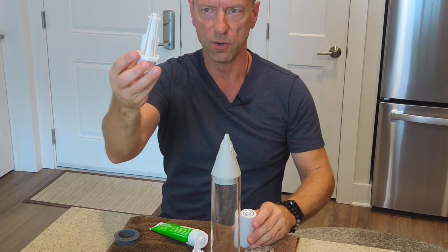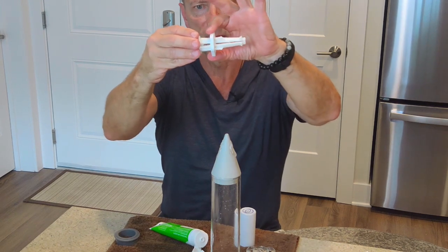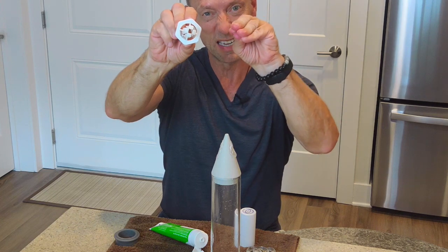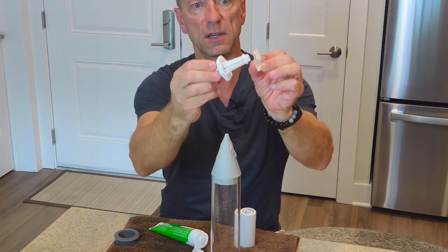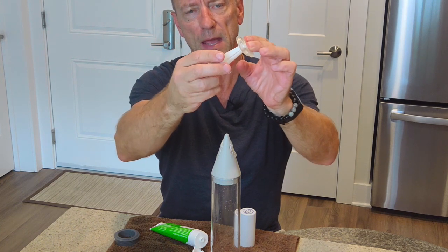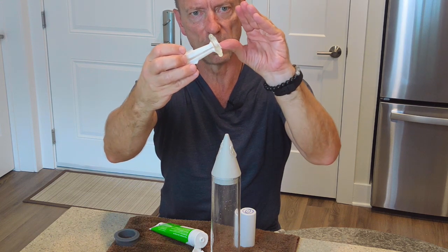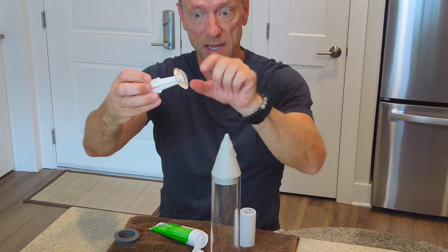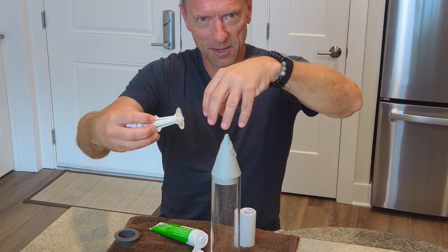So what I want to do is take the hex nut, and this is all in the instructions. I'm going to bring this down and reach a click and hold that in place, and that brings those fingers together to a tight place. Then I want to take this tension ring, and you can see here that it fits in there nice. And then I want to release the hex nut so that the fingers can spread a little bit apart, because as we drive this down onto the cylinder, these fingers have to embrace the cone as we do that.